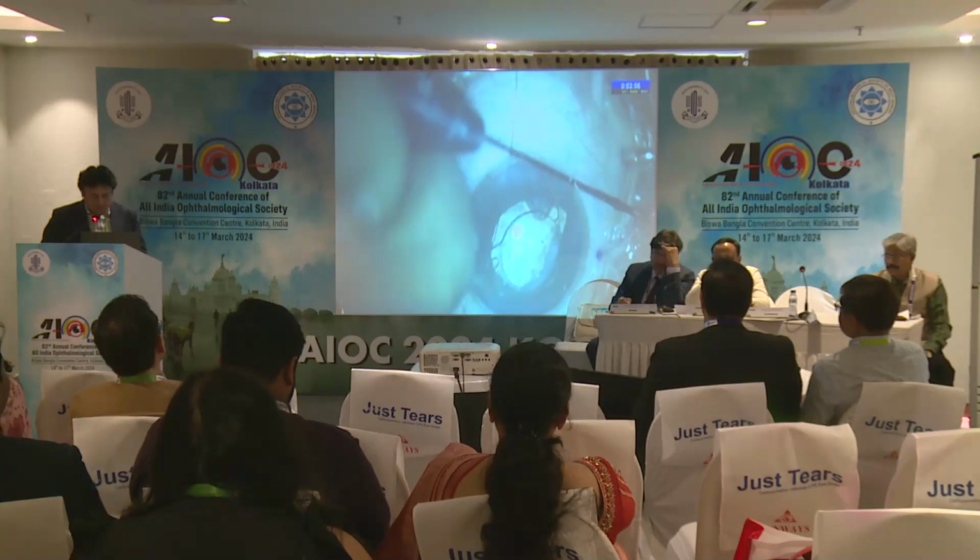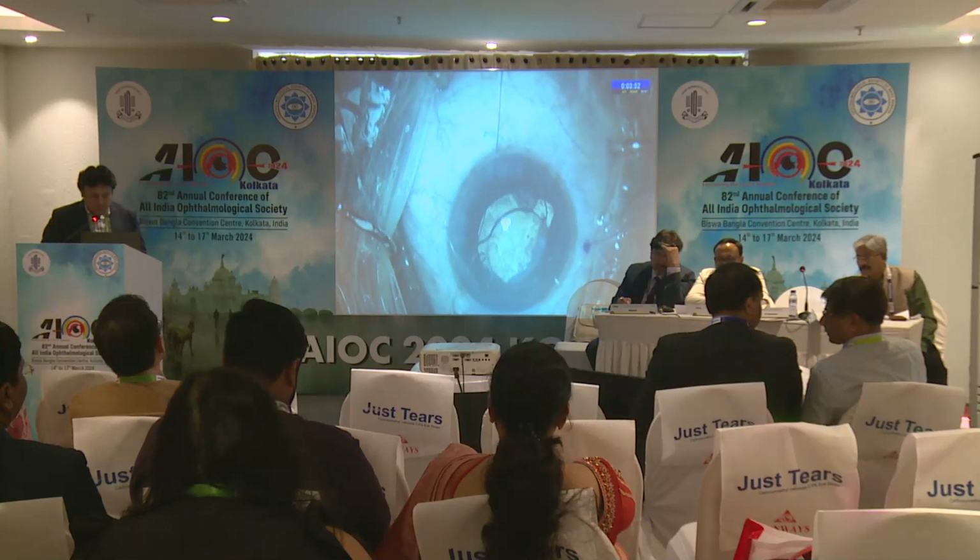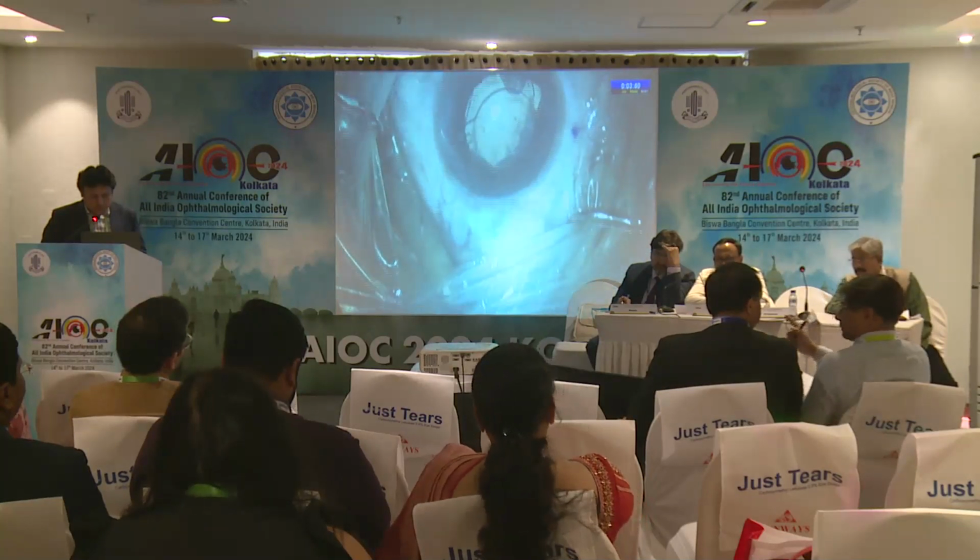Now, after marking diametrically opposite points, a needle is passed and the Prolene is brought out. The same step is carried out on the opposite side.